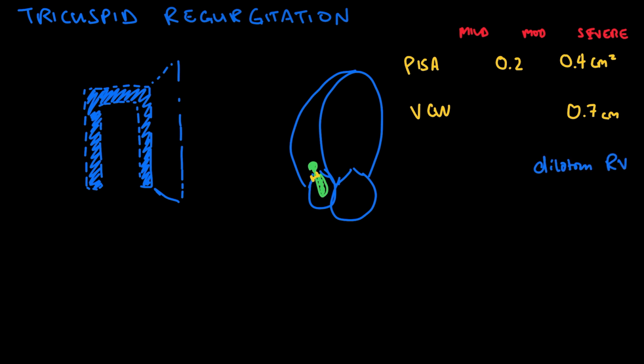of the right ventricle, and you may see systolic reversal of flow in your hepatic Dopplers. What is the idea there? The idea there is that you have so much regurgitant flow that it's going back to your SVC, your IVC, and all the way back down here. And if you measure flow in the liver during systole, you're actually seeing that flow reversing there in the liver as well. That's the idea behind this, looking for systolic reversal in the hepatic Dopplers.